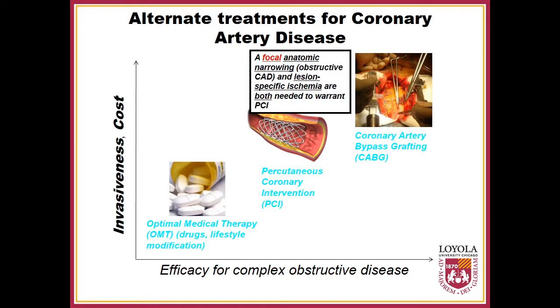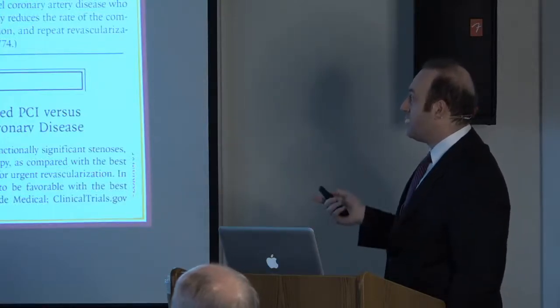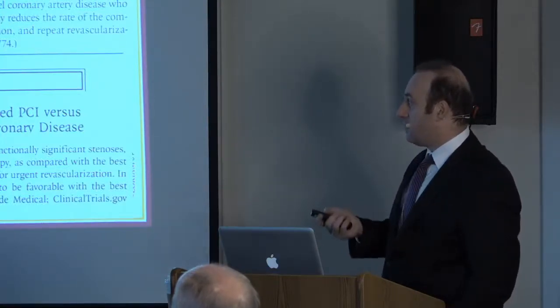So we've seen a major paradigm shift over the last decade or two away from a revascularization strategy guided by anatomic stenosis, the so-called oculostenotic reflex, to one that bridges both the anatomy and the physiology in guiding revascularization.